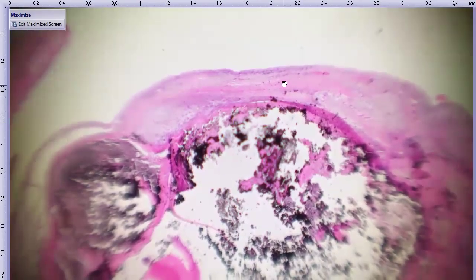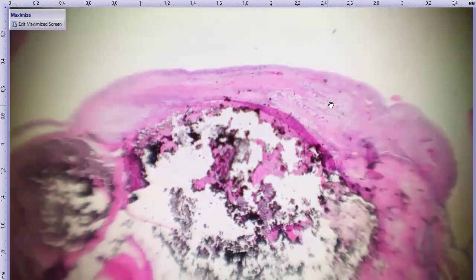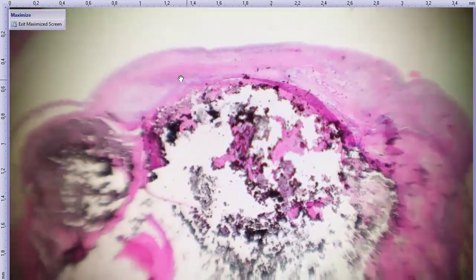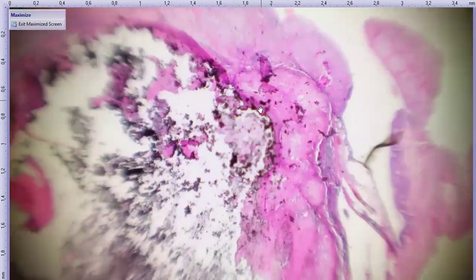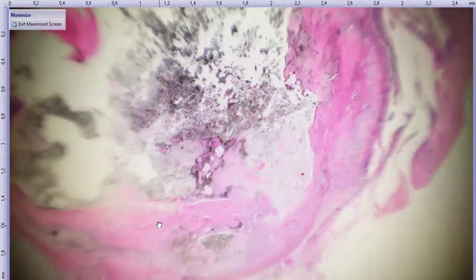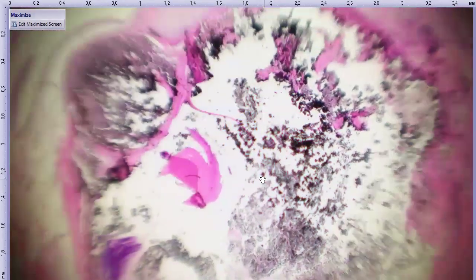You got the epithelium, a little bit of stroma left, and that white infiltrate corresponds to these areas right here. You see we're going around. A lot of this is artifact. A big tumor like that sometimes doesn't get completely fixed when you just immerse it in formalin. So a lot of what we're seeing here is artifact, either fixation or tissue necrosis.